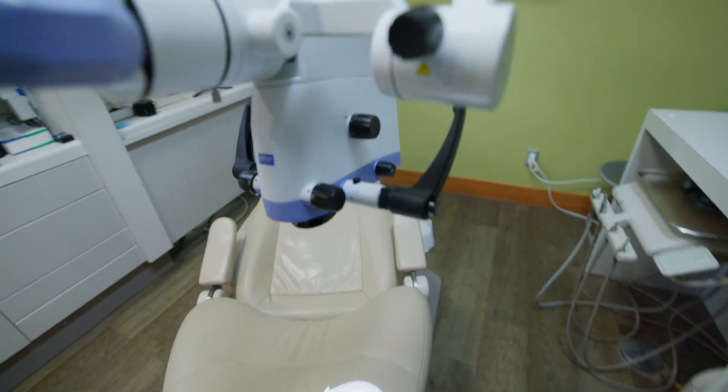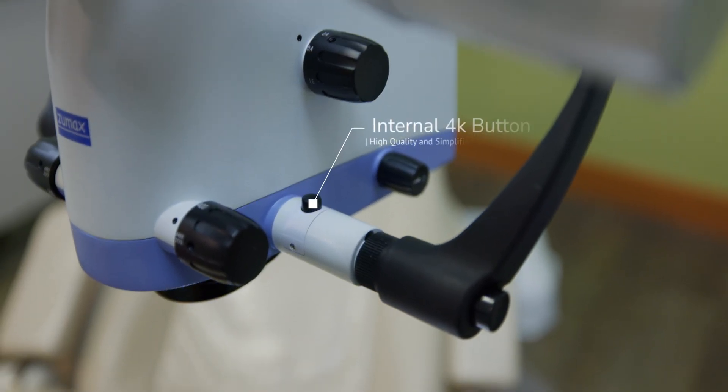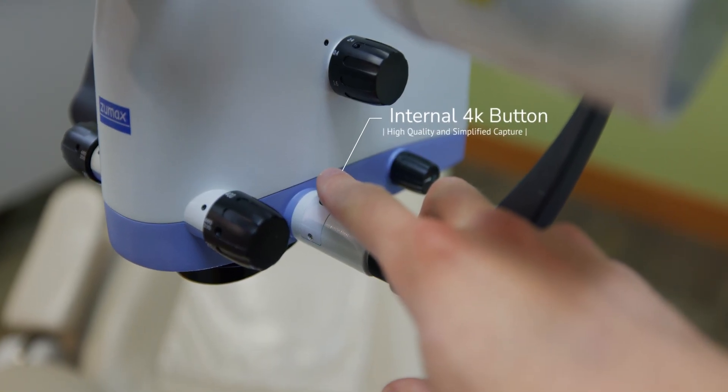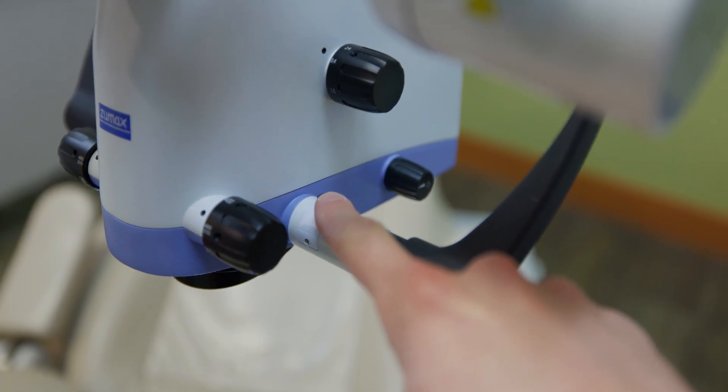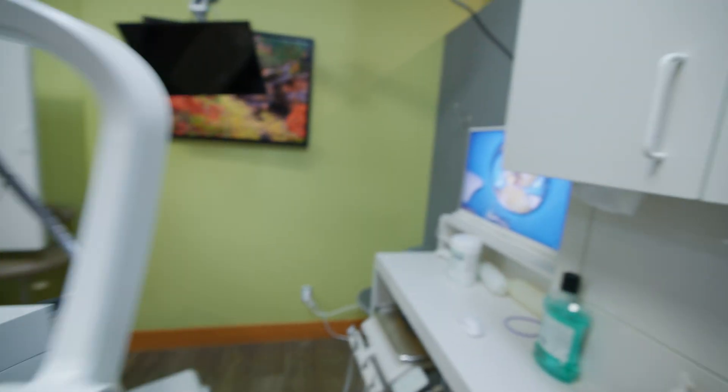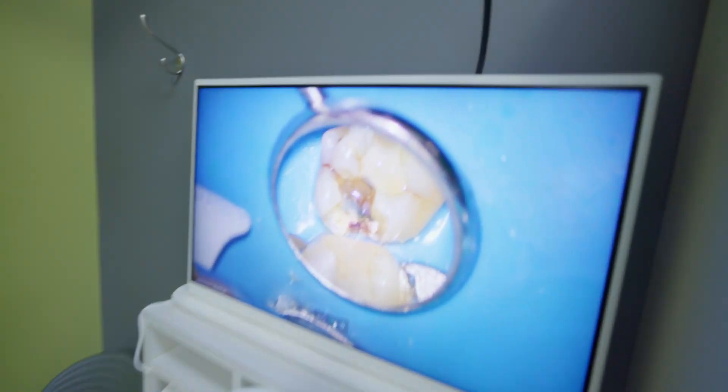There's an internal 4K camera built into this microscope, and the way you activate it is this little button here. You just hit it one time to take a photo, and then hold it for three seconds and it will start taking a video. I've got mine hooked up over here — this is a photo I took today of a cavity during a procedure. Super easy to do, and the photos are really, really good quality.